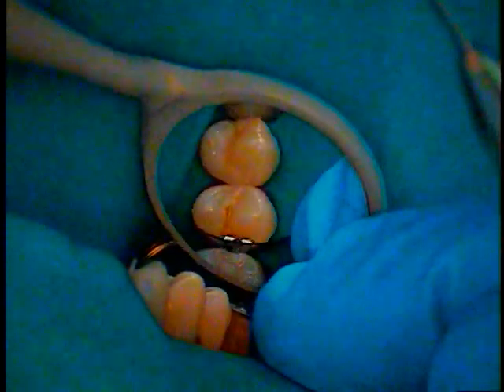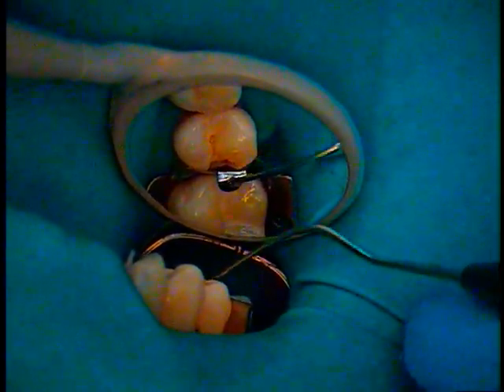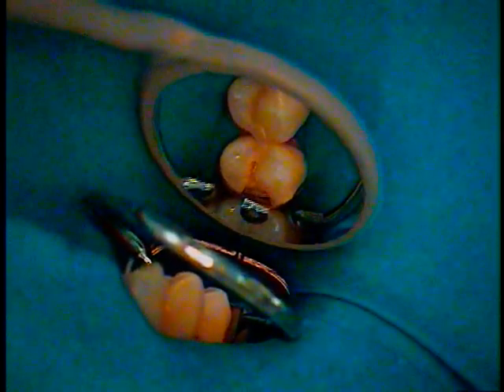Just about ready for the tine. Okay, it's in. Okay, here's the tine. You're going to feel a little pressure, all right? All right. I'm going to double check with an Explorer.